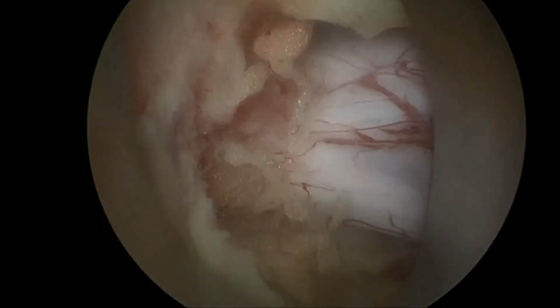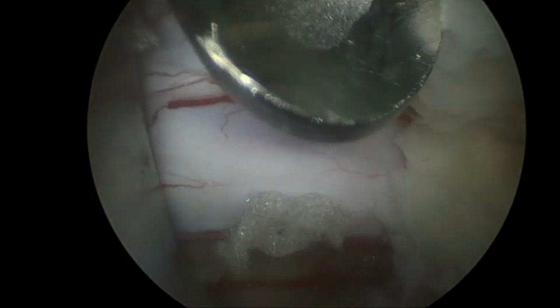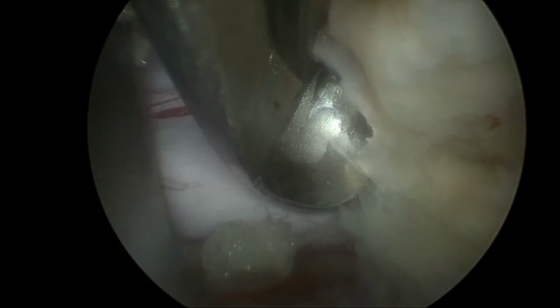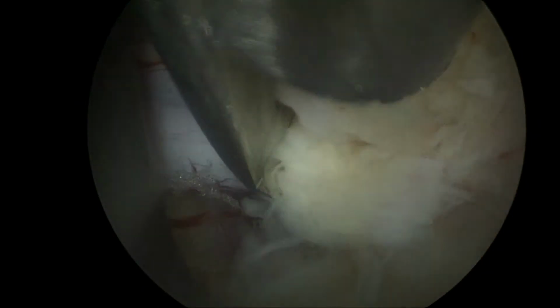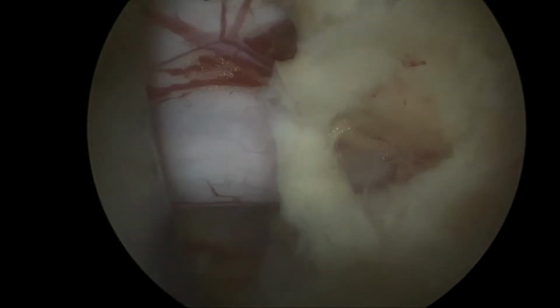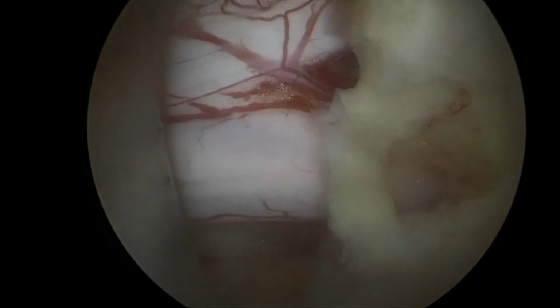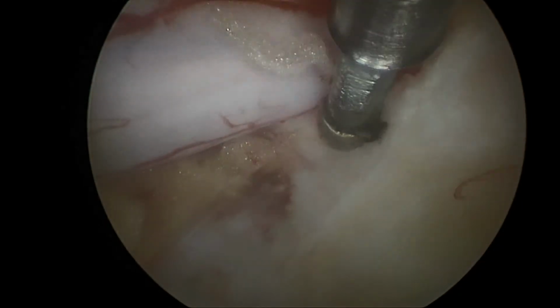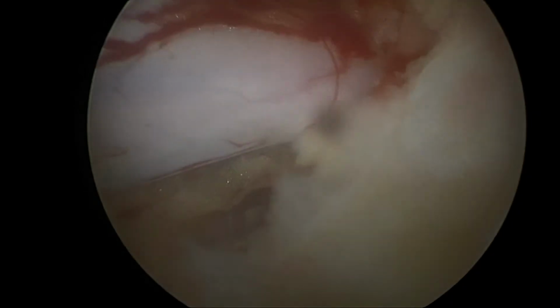The endoscope can be turned in order to obtain the best visualization of the anatomy. And you always want to visualize the tip of your instruments. Here, the remaining yellow ligament is lifted off the remaining lamina of S1.